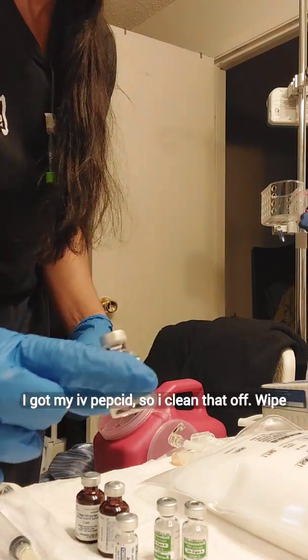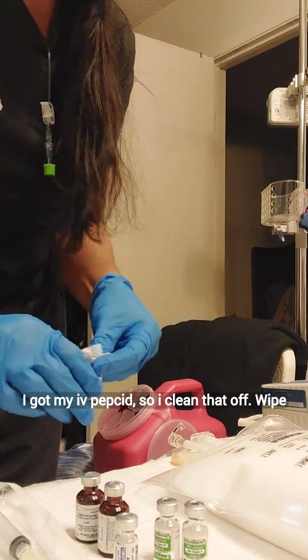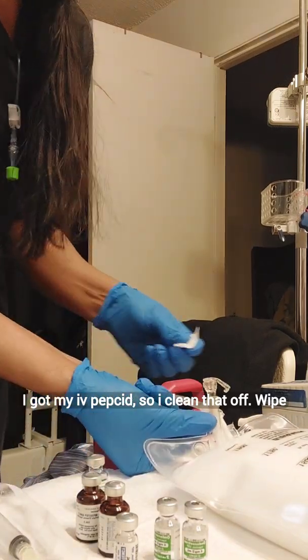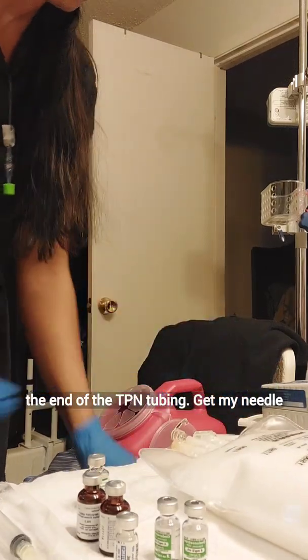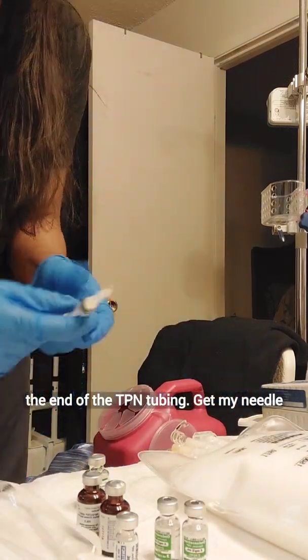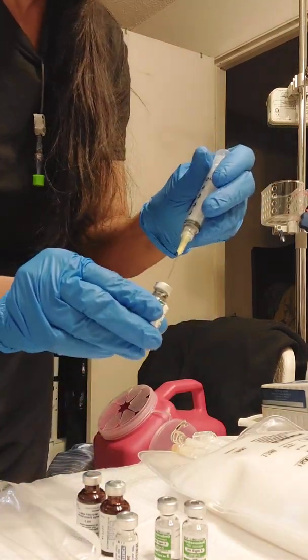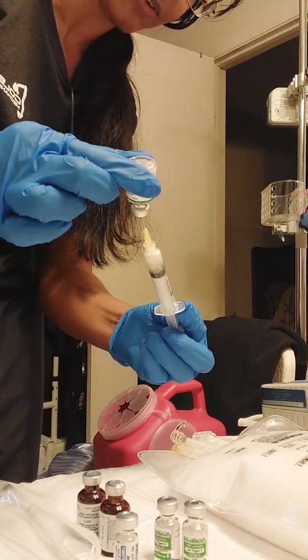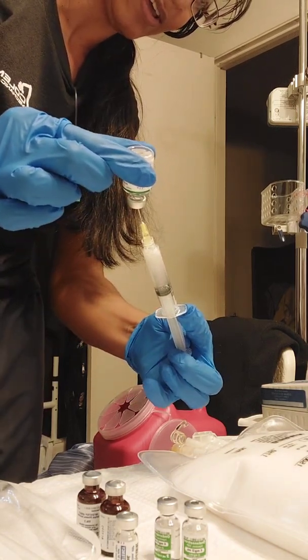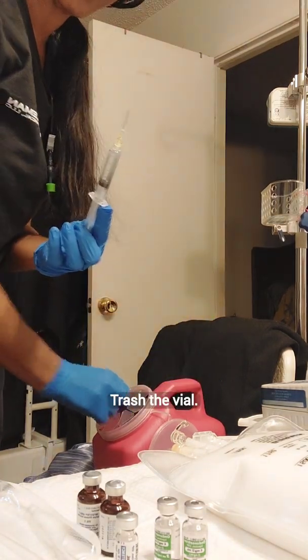I got my IV Pepcid, so I clean that off, wipe the end of the TPN tubing, get my needle for that, inject, and trash the vial.